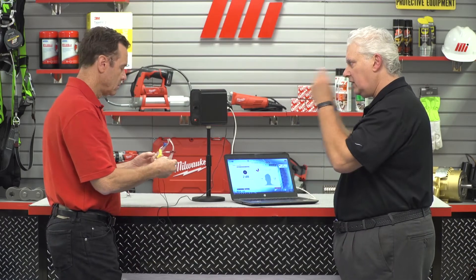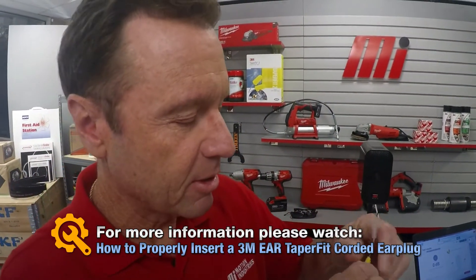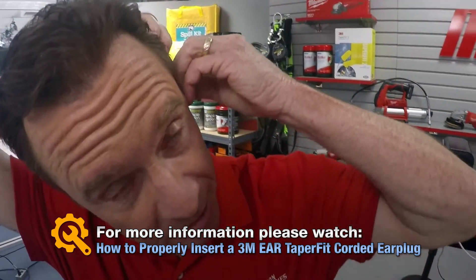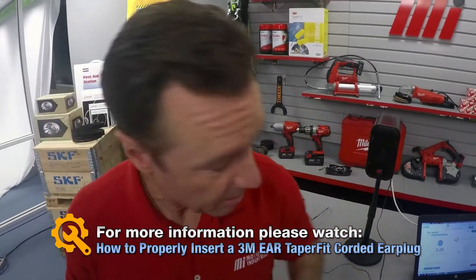You received a score of two. So many people that use earplugs really don't get the noise reduction that they should. You've selected the taper fit two. Now let's try that again. This time, roll them down and insert them correctly. So we roll this — we have to roll it first, and then you have to pull the ear.